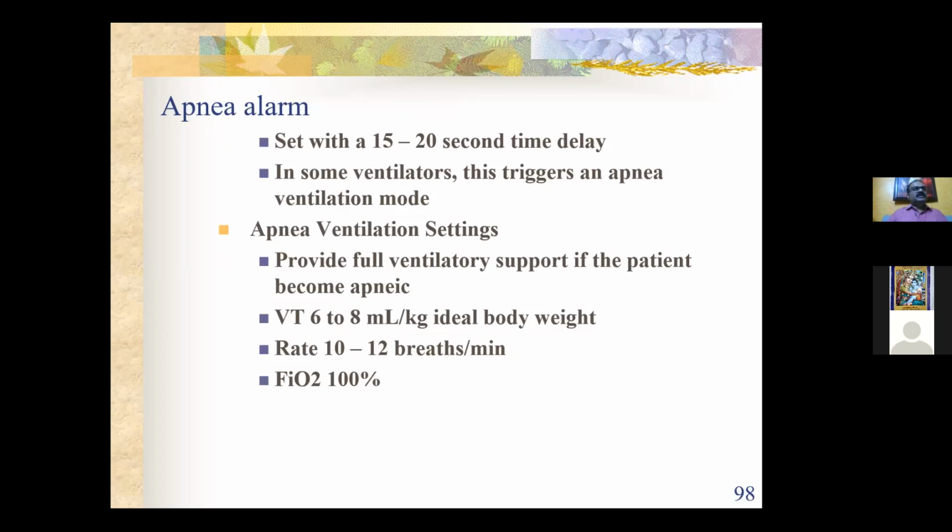Then there can be the apnea alarm that we already told you about, basically in a pressure support mode of ventilation. When the patient is spontaneously breathing and the patient is not triggering the ventilator for 15 to 20 seconds, then the machine should go into an apnea mode, or the machine should start giving controlled ventilation. So when you set the alarms, there will be apnea in pressure support ventilation. There will be apnea ventilator settings also. That also you have to set.